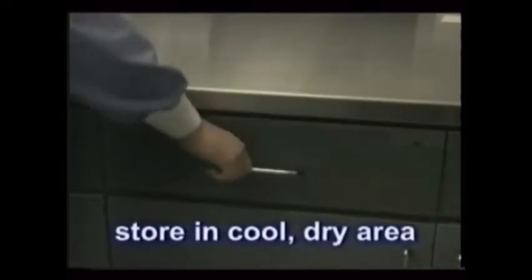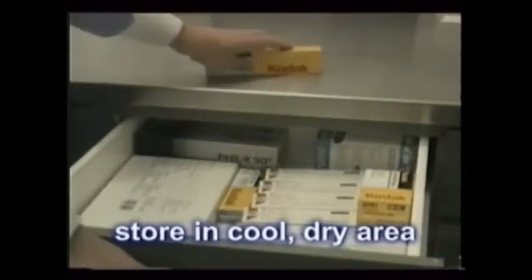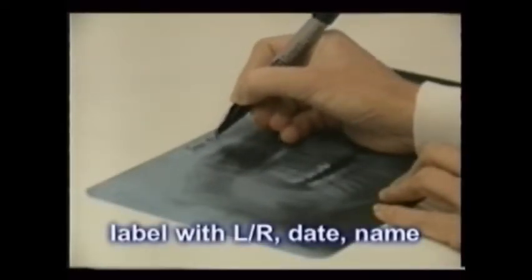X-ray films should be properly stored in a cool, dry area until they're used. Refrigeration is ideal but not mandatory. Just remember to warm the films to room temperature before you use them. All films should be labeled after use.